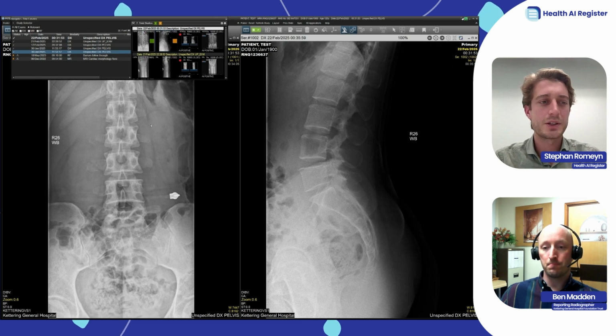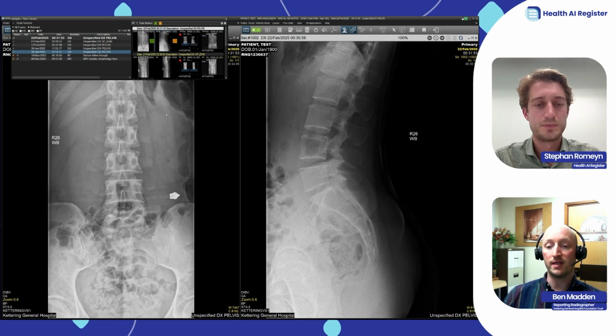Okay, I understand it correctly. So you then, of course, use the AI output in your reporting, but you still look at it yourself. And also you keep close contact with Radiobotics to show them these missed findings, and there's a system in place also to monitor this performance over time for this application. Yeah, ED are advised that the official radiology report is gold standard, and it's not something that you rely on too heavily. You just use it as a guide. And we have a safety audit in place that ED do every day, and they pick up on any fractures that we call.